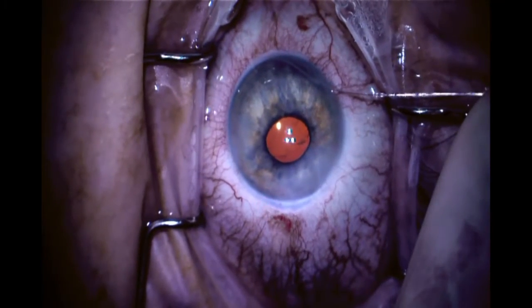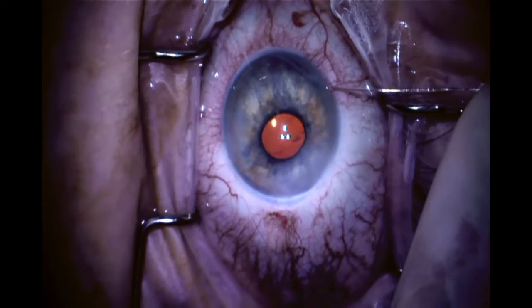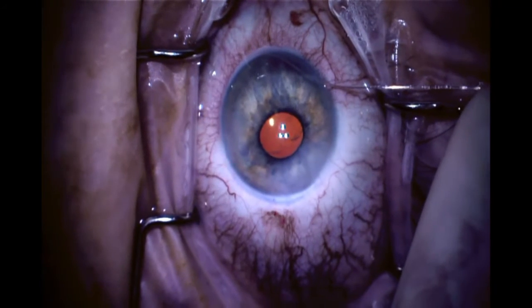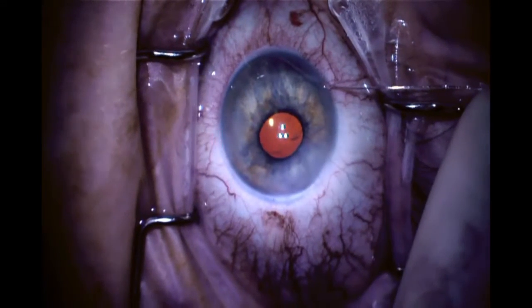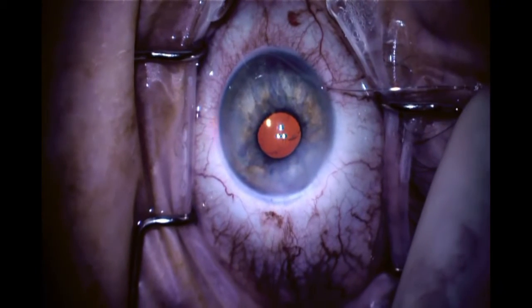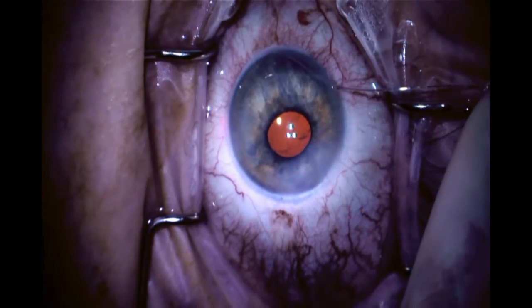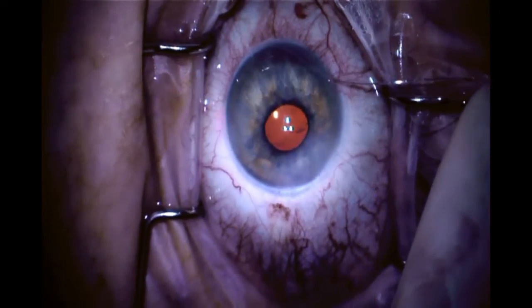Every clock hour, I ask the assistant to click and inject a little bit more viscoelastic. Ultimately, you can see that we end up getting prominent episcleral blanching for about 270 degrees.